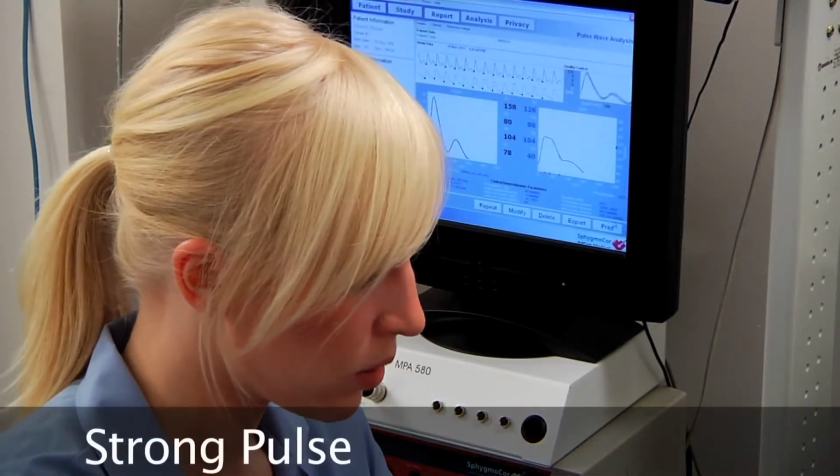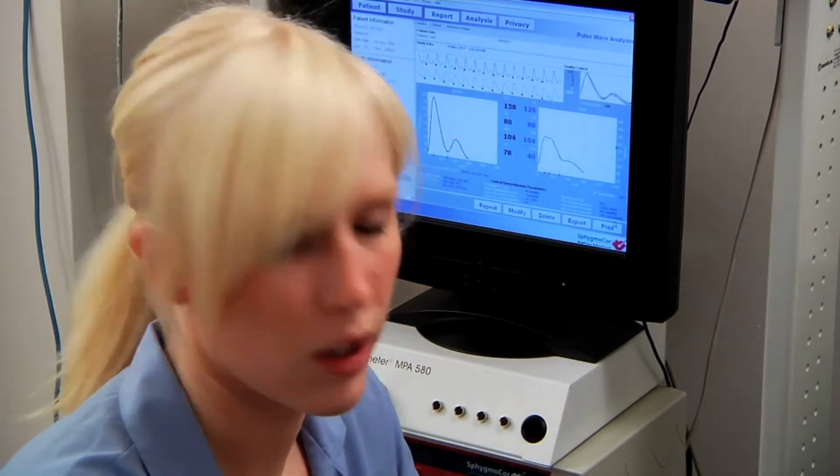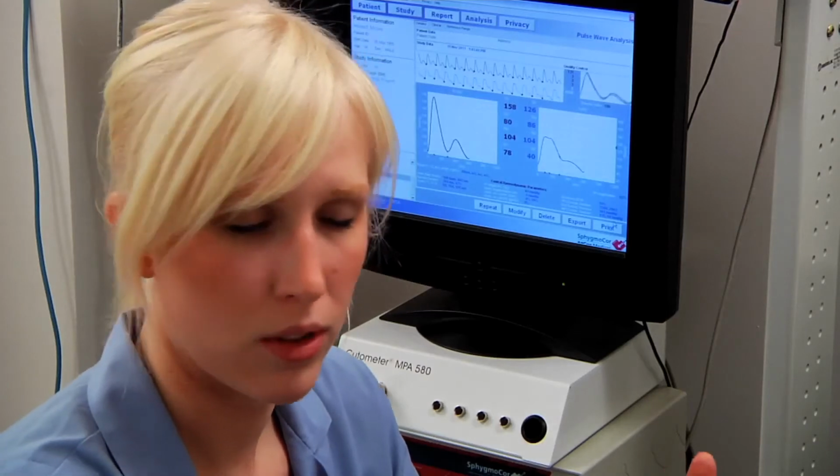The other thing is sometimes you'll put your finger on their pulse and it'll be a really bounding pulse, and you'll think it's going to be a really good measurement because their pulse is very easy to find. Those pulses are actually often the worst measurements, because when you place the probe on the pulse, it's so strong that it'll push the probe off of the artery, and then you can't get a measurement.